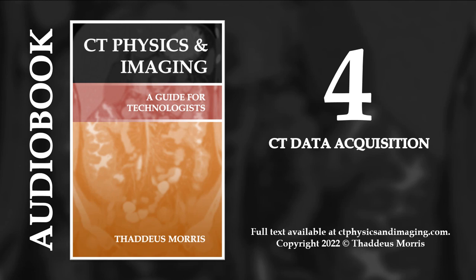Helical scanning, also called spiral scanning, receives its name based on the path the X-ray tube takes around the patient. The shape of the data acquisition pattern, in Figure 4.4, has the appearance of a helix or spiral. Unlike axial scanning, which acquires one section of data at a time, a helical scan captures one large spiral of data while the tube and the table are in constant motion.